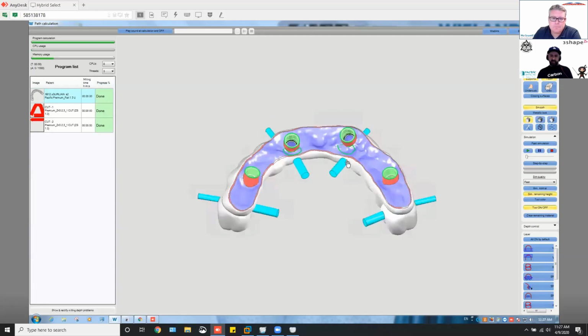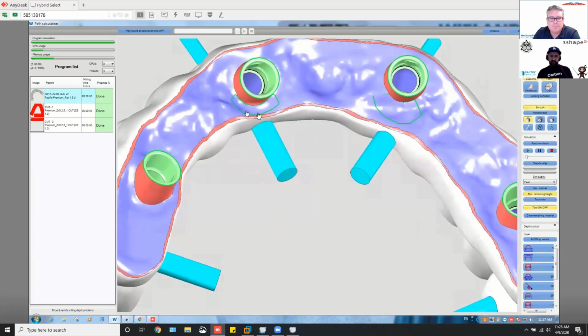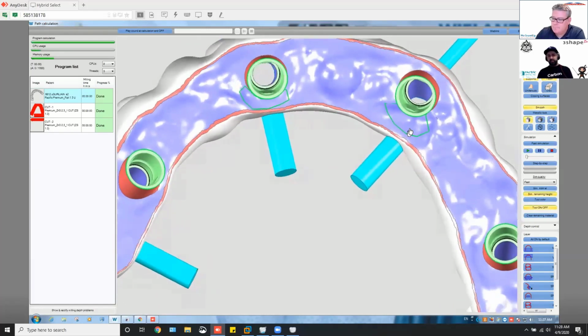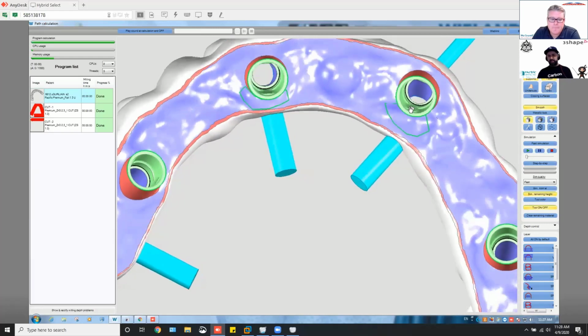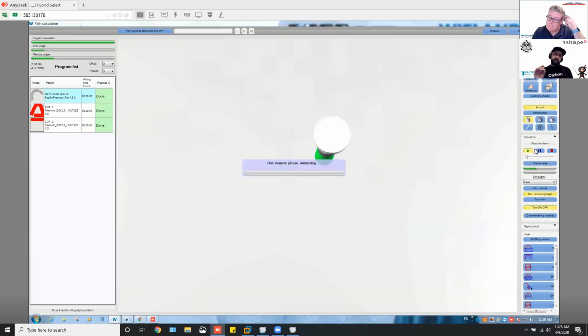But you can see I actually had to come in here and add an area. Like in your days with Hyperdent, you can come into a user-defined area. It's not called user-defined here. I actually created a new insertion direction and defined the area. So in a way, it's user-defined, and you can see that this case right here has an angled screw channel. You can see I'm looking straight down into the tie base, but I can't see the top because it's angled. So these cases definitely all take a lot of time.